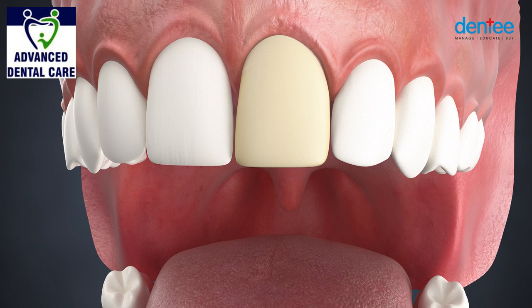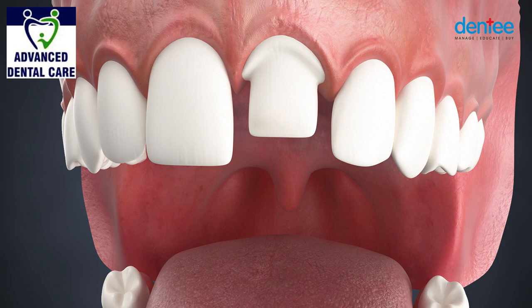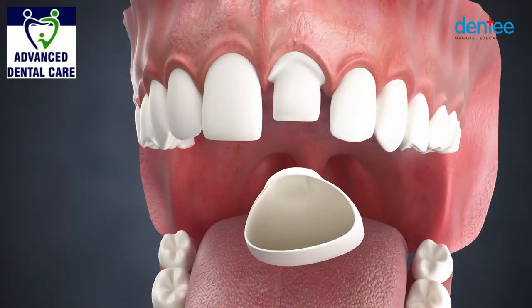After one to two weeks, the permanent crown will be ready. The temporary crown is now removed and the permanent crown will be cemented onto the prepared tooth.